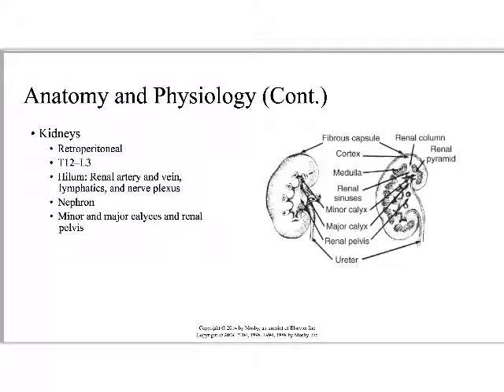In terms of where these functional units are situated, again, retroperitoneal about the level of T12, so just below maybe the xiphoid process, you're probably in the area of the kidneys. As I've been instructing the junior students on setting up for KUBs, asking the patient to indicate where the xiphoid process is is helpful, because I have a general idea that I'm about in the area where the kidneys need to be in terms of my light field for x-ray.